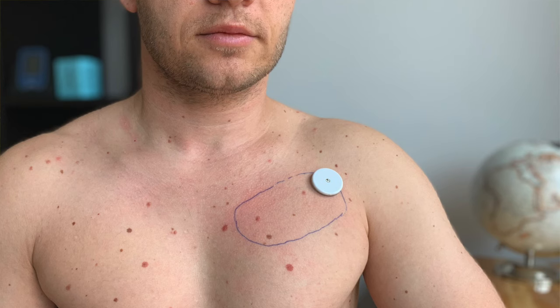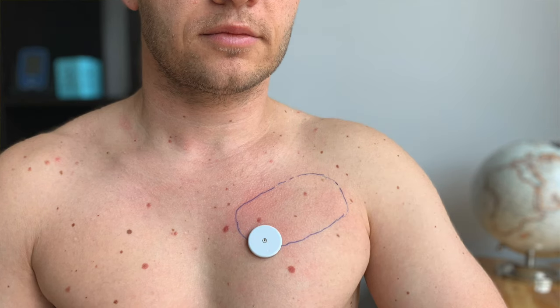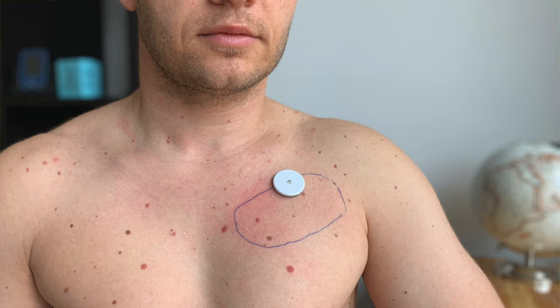For me, the best and my number one most favorite area that I've tried is the chest. This site is very flat, so my sensors stick there very well and I do not bump into anything. It is the most durable spot I've found on my body so far and it gives me pretty reliable and accurate readings. For me, it's also a very comfortable and discreet option.